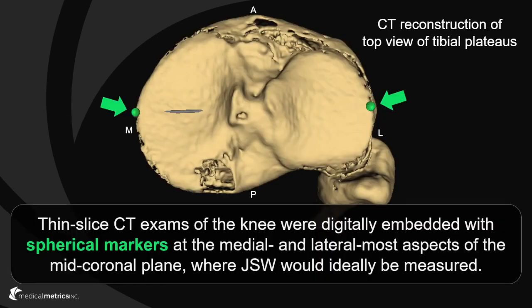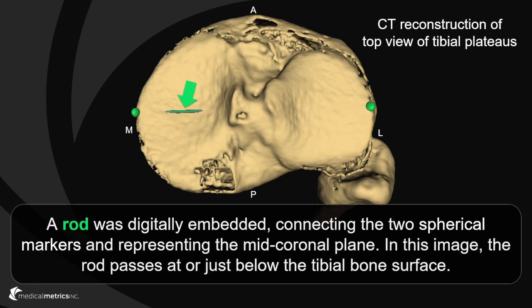This is a view looking down on the tibia plateau of a right knee. Thin slice computed tomography exams of the knee were digitally embedded with spherical markers at the medial and lateral most aspects of the mid-coronal plane of the tibia. This is where joint space width would ideally be measured. A rod was digitally embedded connecting the two spherical markers and representing the mid-coronal plane.